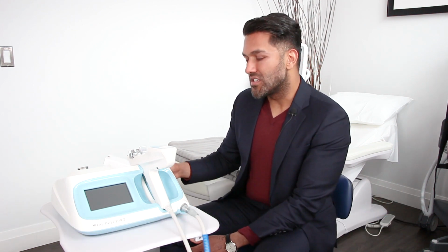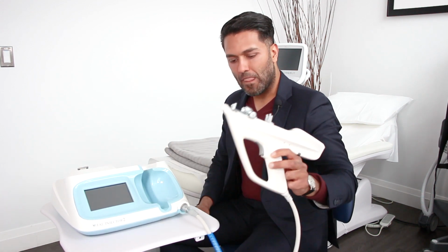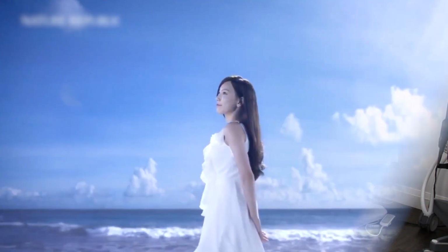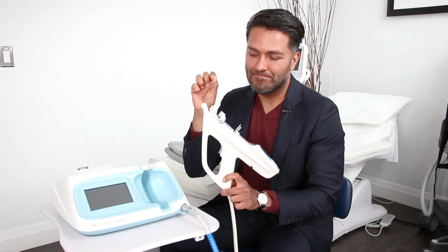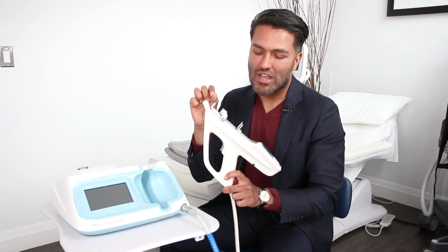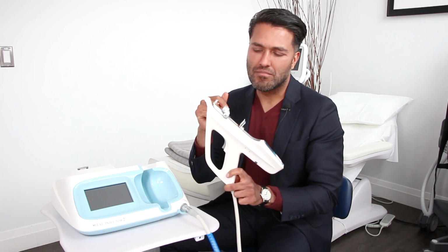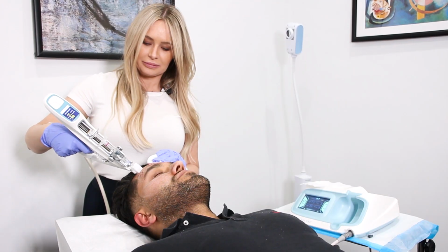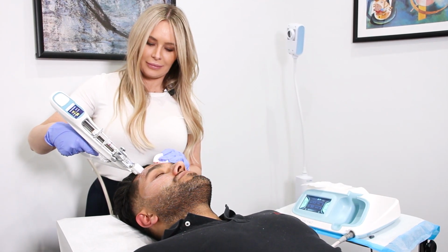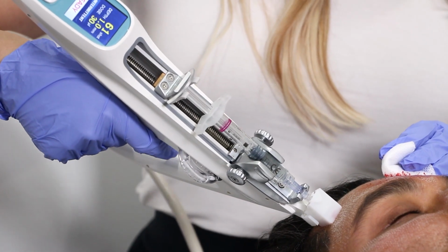What we are doing is we are microneedling the skin at a very high intensity using this device. This device comes from South Korea, the home of skincare innovations. It's suctioning the skin nice and tight, and then it's injecting the dermis to a depth of 1 millimeter, 0.8 millimeters underneath the eye. It's a whole facial treatment, and the small microneedling channels will lead to new collagen formation over a period of 6 to 8 weeks.